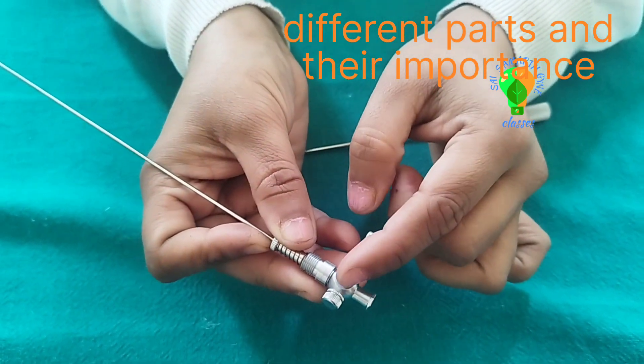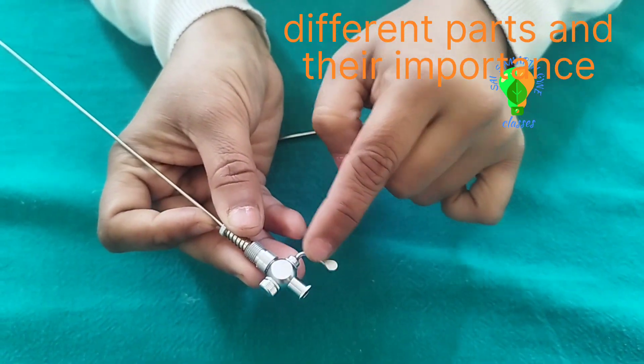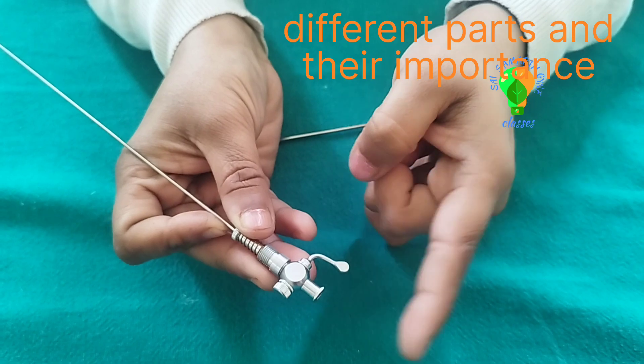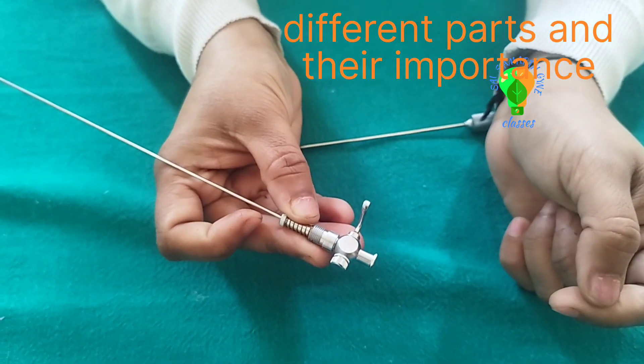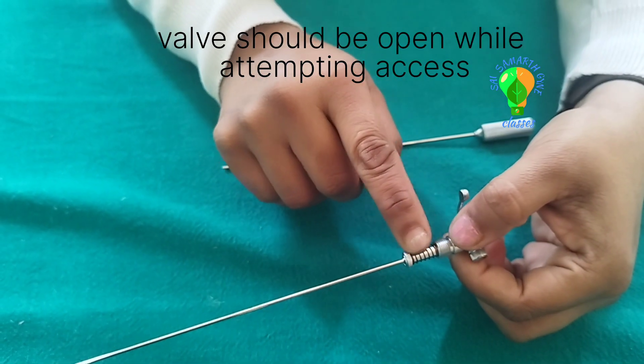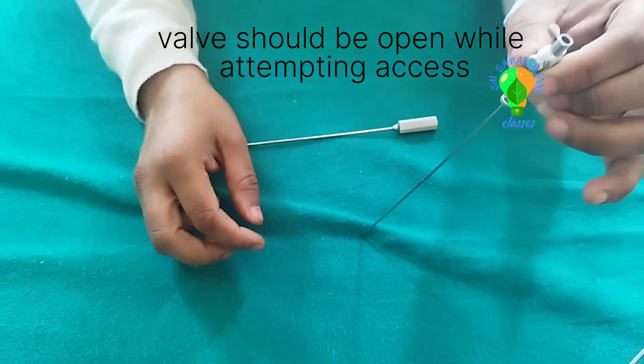This valve is aligned — when it is aligned, or the stylet is parallel, then air entry is open. When it is perpendicular, the air entry will be closed. There is a spring inside.